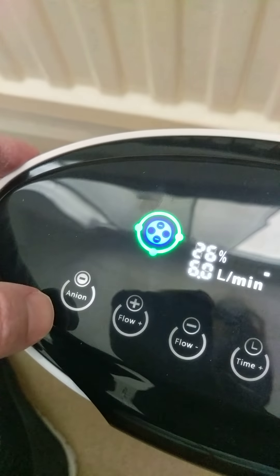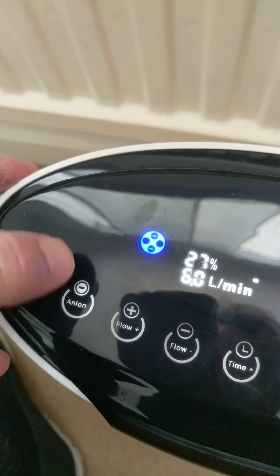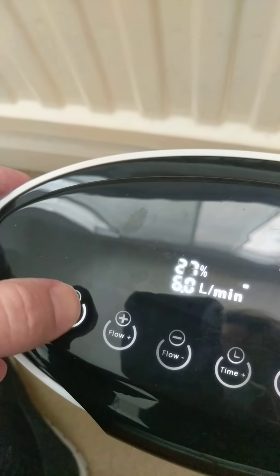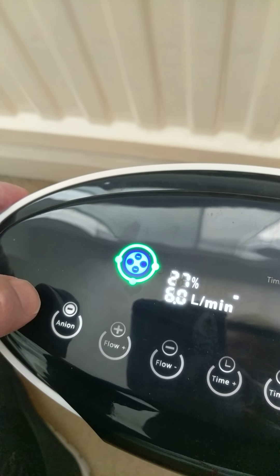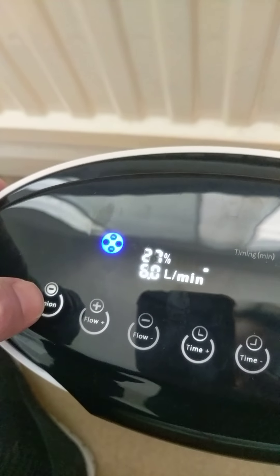There is a negative ion button here which turns that LED on and off. What that's for I don't know — I haven't got a clue. Someone could probably tell me in the comments.